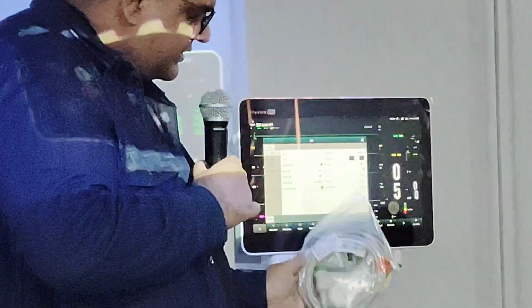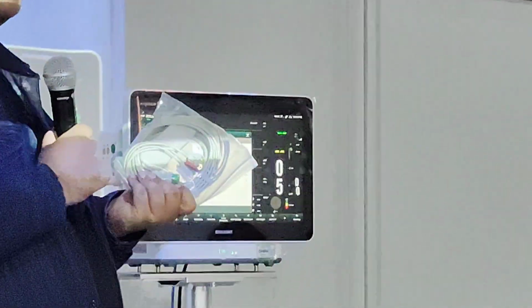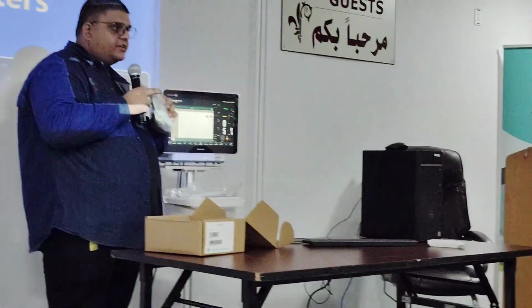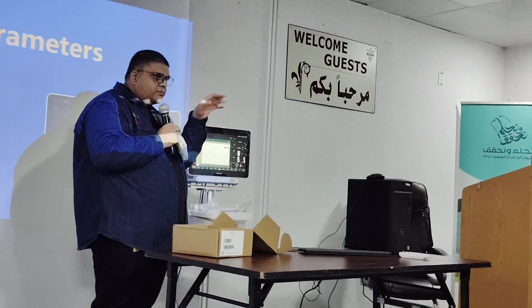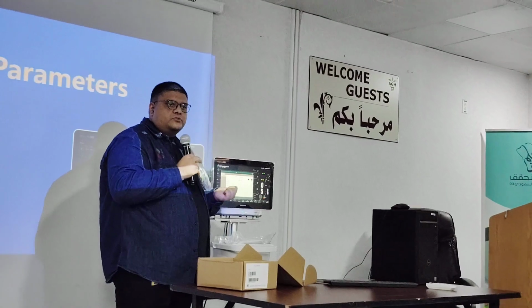The advantage of using auto lead type is you don't have to worry about what lead you're using. Maybe one patient came in with 3 leads, the other came in with 12 leads. You can't go in and change every time, right? Having it manually let you select is useful if everyone in this department is just using one type of lead, then I can just choose 5 leads.